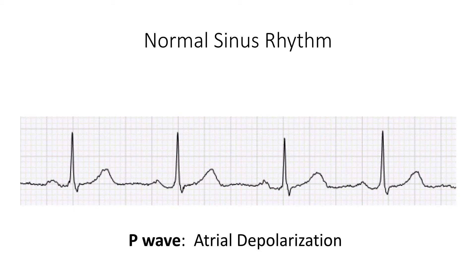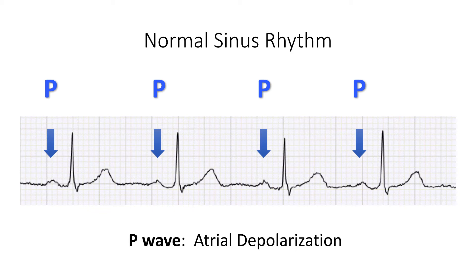What you see in front of you is a single lead electrocardiogram in a patient with normal sinus rhythm. The P-wave is the start of a normal sinus rhythm. The P-wave represents electrical depolarization that emanates from the sinus node and spreads throughout the atria, usually from the right atrium to the left atrium, because the sinoatrial node is in the right atrium. The best leads to visualize a P-wave are lead 2, because it points in the direction of the wave of depolarization of the heart, and lead V1, because V1 is an anterior lead, and the sinoatrial node is an anterior structure.